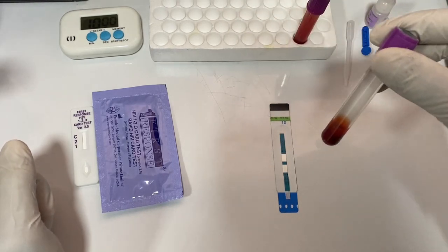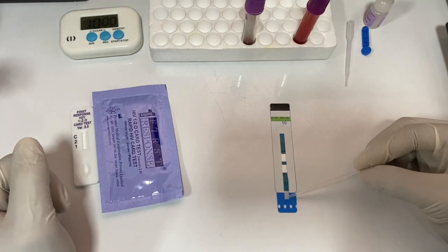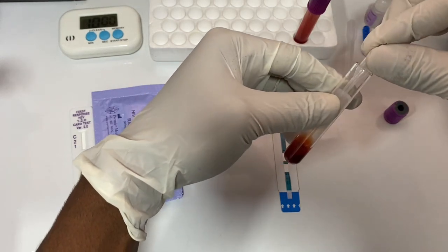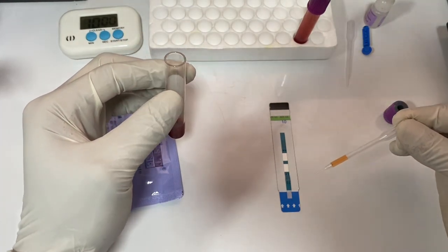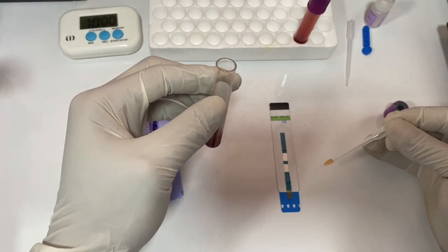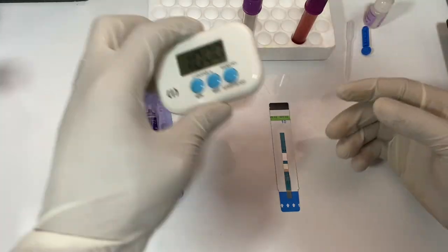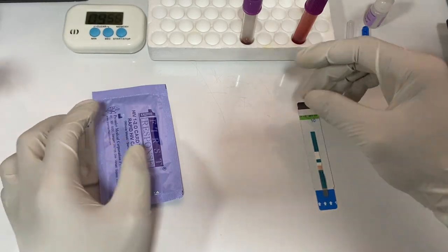I have a sample here that has already been spun. I'll take the serum and put it at the sample area. With my Pasteur pipette, I have aspirated some of the sample. I'm going to put it in the sample area — two or three drops is enough. I put the rest back and discard my Pasteur pipette. You're actually going to wait for 10 to 15 minutes, so this is basically our timer.